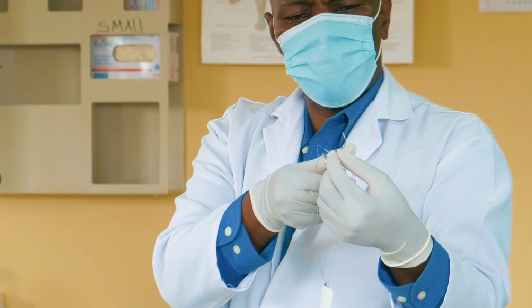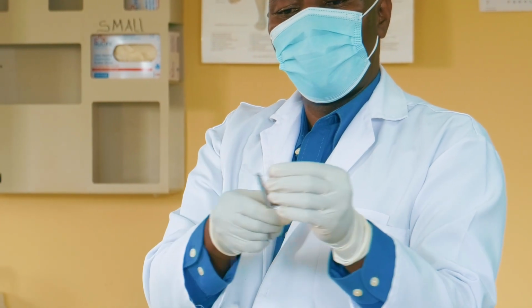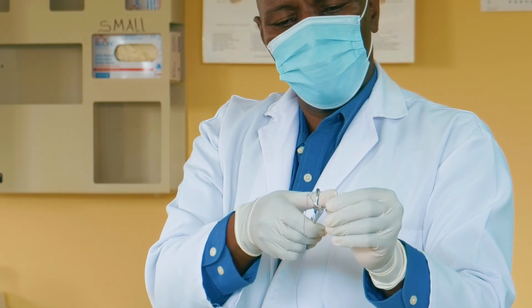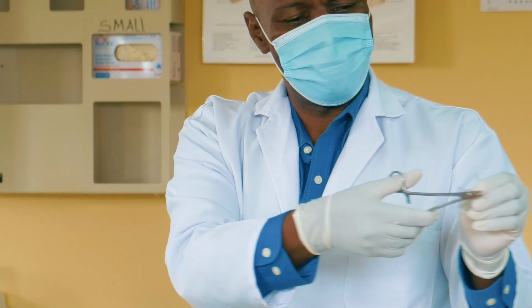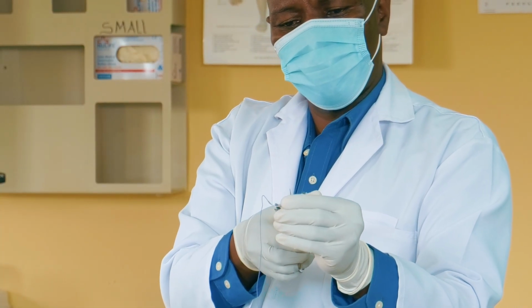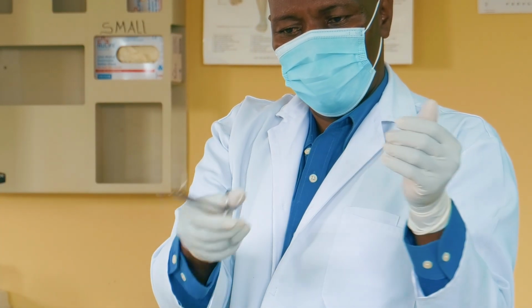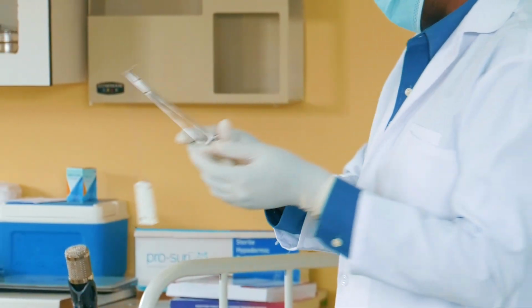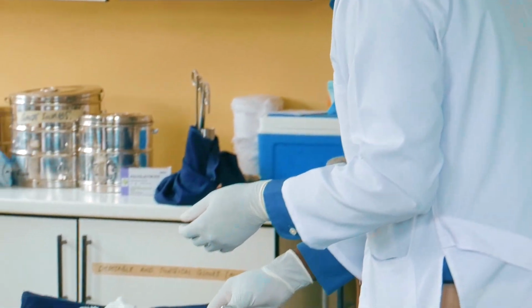Sometimes in theater, you may have tissues that you are suturing. This is not supposed to go like that. Have you seen the difference? So it should just be the tip enough to hold there. Yeah, it should be there. Okay? Alright, so this is prepared.